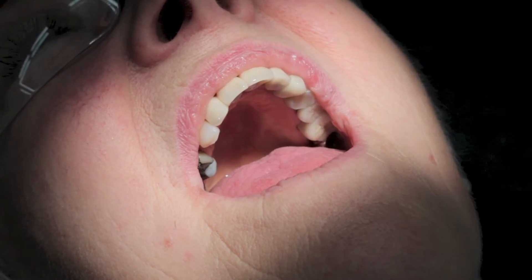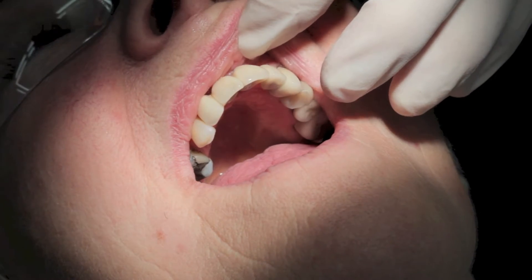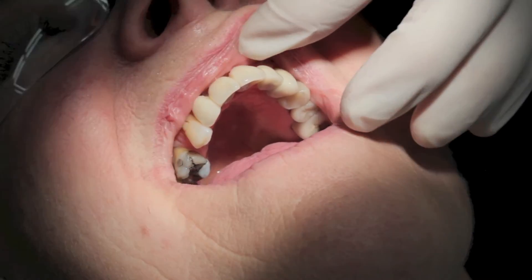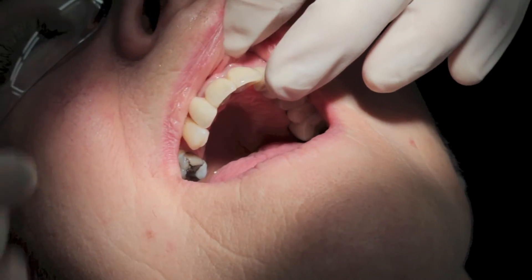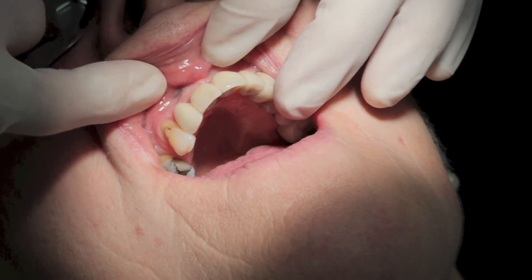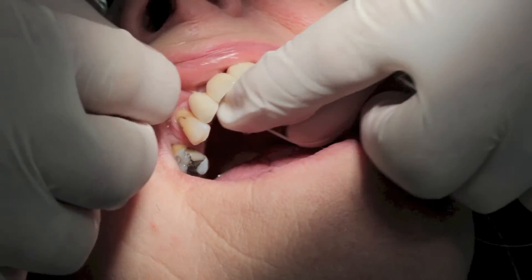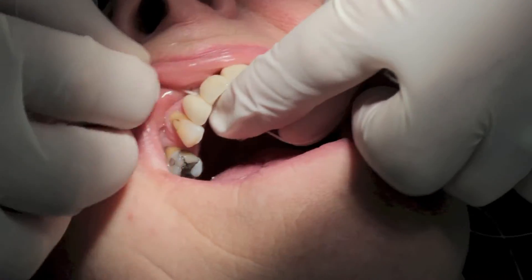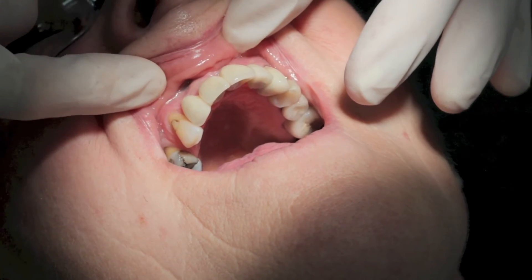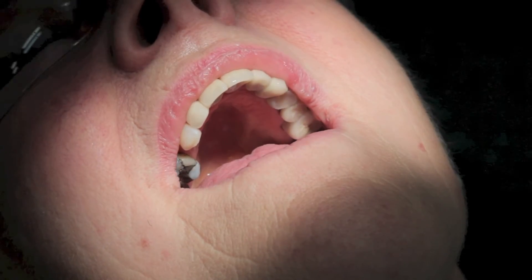And finally we'll check that it's possible to clean around the new teeth. Super floss underneath the pontic fits very nicely, and the teepees between the implants. And that is it for the fit appointment — we'll review the situation in one month to ensure all is well.